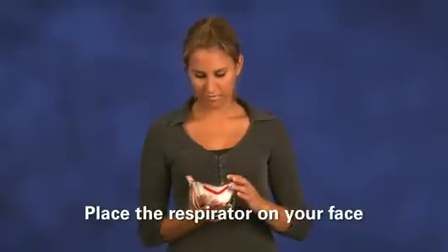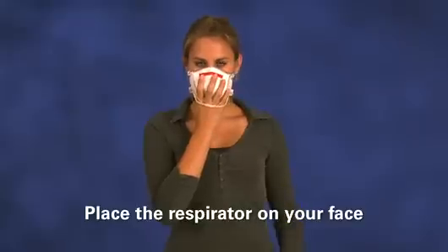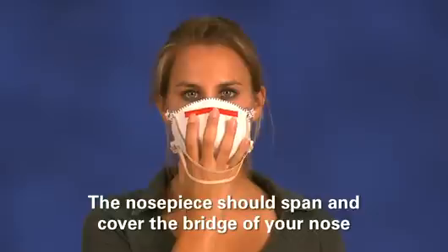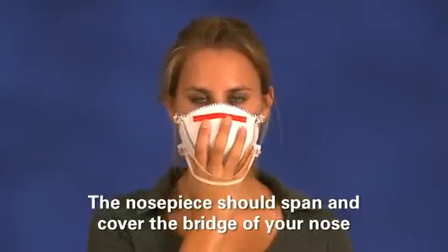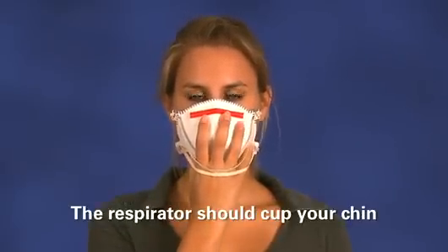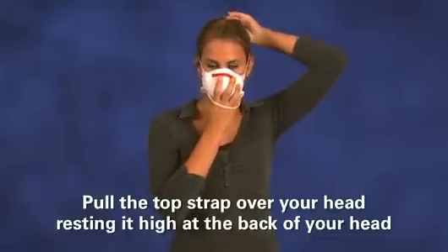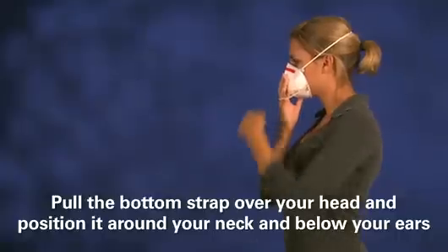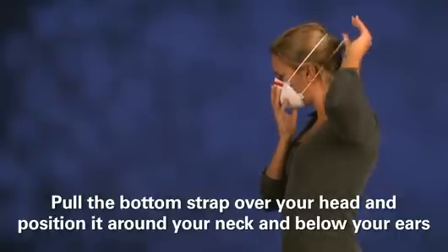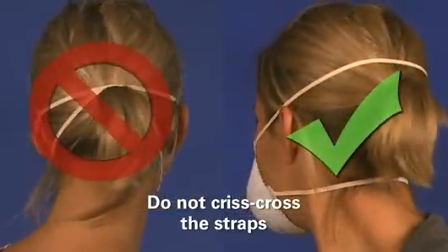Using one hand, place the respirator on your face with the nose piece at your fingertips, allowing the headbands to hang freely. The nose piece should span and cover the bridge of your nose and the respirator should cup your chin. Pull the top strap over your head, resting it high at the back of your head. Pull the bottom strap over your head and position it around your neck and below your ears. Be sure not to crisscross the straps.